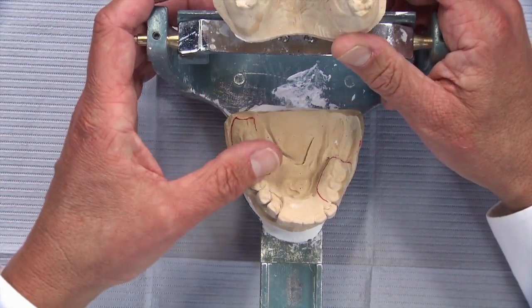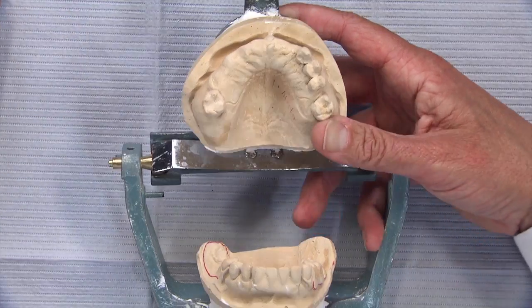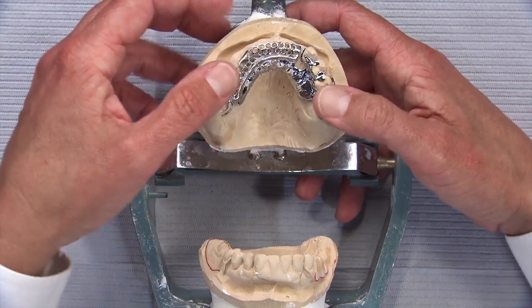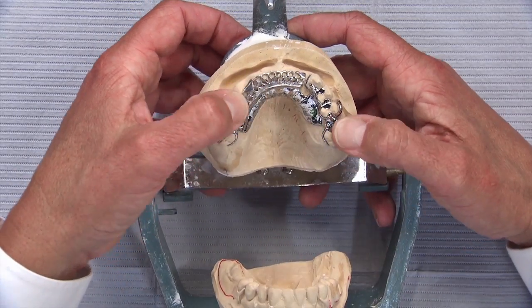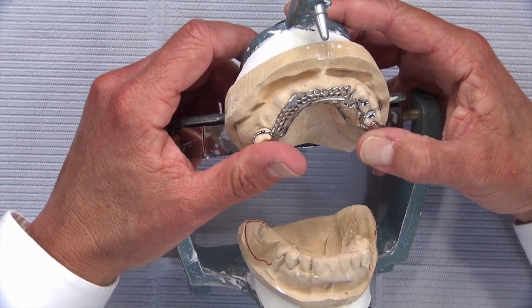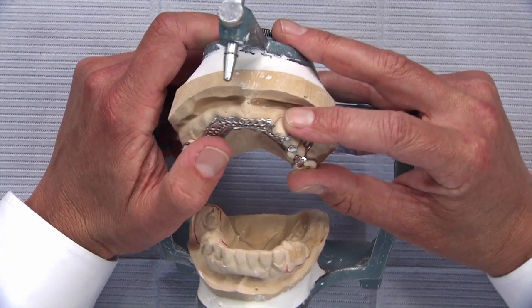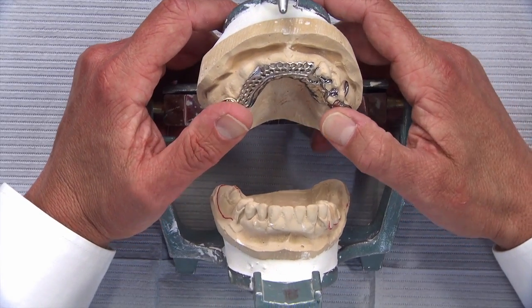And so the doctor is going to build that up and get an impression of that for us and get a bite. And in the meantime, the framework has been made, and so I'll put this into place. And you can see that number 11 has been clasped with, again, what we would term an aesthetic clasp because it's not out on the facial and therefore readily apparent. Any clasp on number 11 usually will be seen.